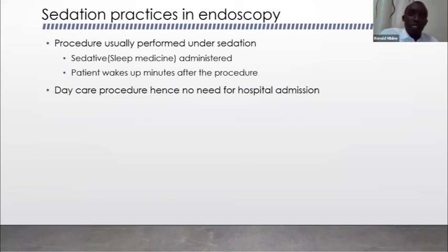Most of the questions people ask actually about this: is it painful? Most of the patients I see come with all these preconceived ideas. A few years ago, endoscopy was done what we call non-sedatively. Non-sedatively means you basically lie on the bed and the procedure is performed when you're fully conscious and aware of what's happening. Progressively, as time goes on, we are adopting better sedative practices. And basically what that means is that we give you medicine that puts you to sleep. So you have no memory whatsoever of the procedure, and it's generally an enjoyable experience, both for you and the endoscopist.